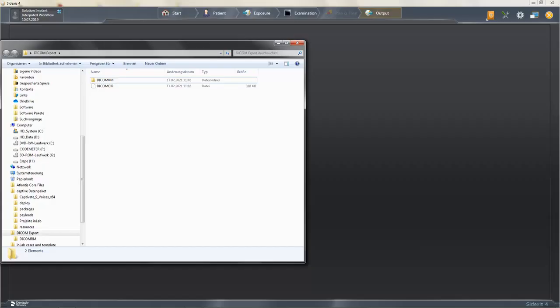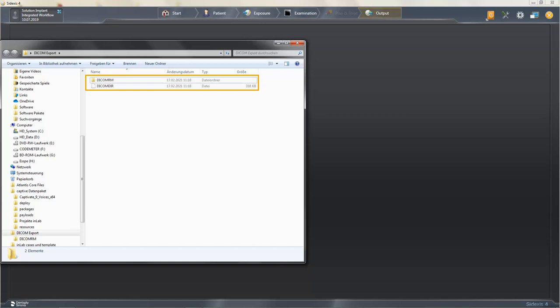In parallel, we called up our previously selected storage location and now find a DICOMRM folder and a DICOMDIR file. Both are required in order to be able to import the data set again later in Sidexis or another DICOM viewer.